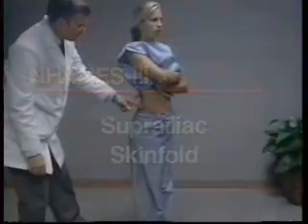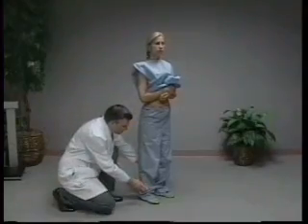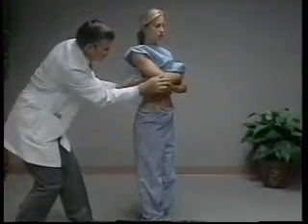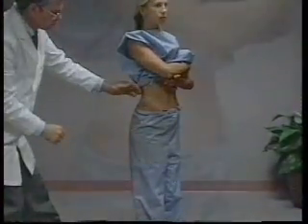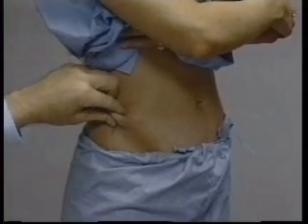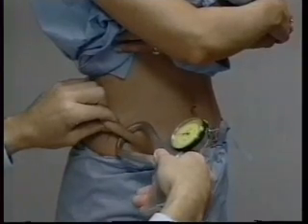The suprailiac skin fold is measured at a point anterior to the mark previously made to measure waist circumference. The subject stands in an upright position with weight evenly distributed and feet together. The examination gown is held so that the waist area on the right side is exposed. The technician's thumb is placed on the intersecting marks and the index finger is placed above and anterior to the mark. The skin fold slopes downward at approximately a 45 degree angle toward the pubic symphysis. The tips of the caliper jaws are placed approximately two centimeters below the fingertips.